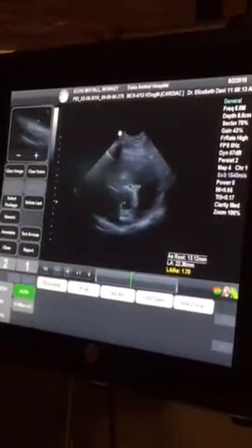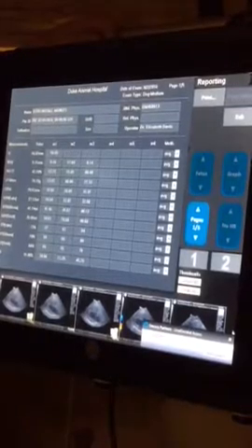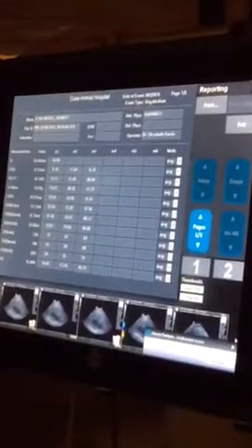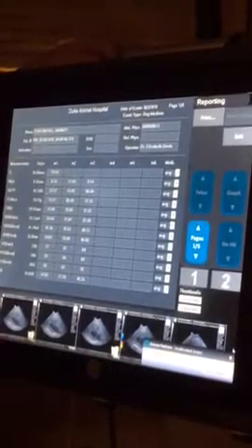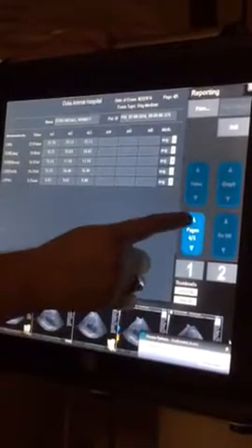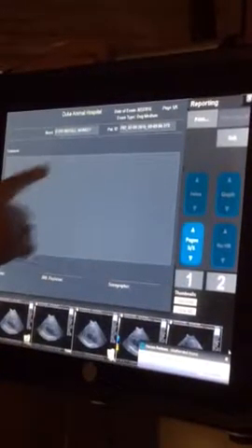Once we're done with our measurements, the last thing we do is hit Report Page. All our measurements are going to be listed here in format for your cardiologist or veterinarians that want this information. So what we do here is use the number one button — go up to page two, number one; page three, number one; page four, number one; page five, number one. Always print that last page. We're attaching all those measurements we've done to the study.